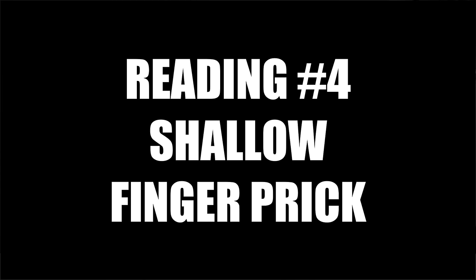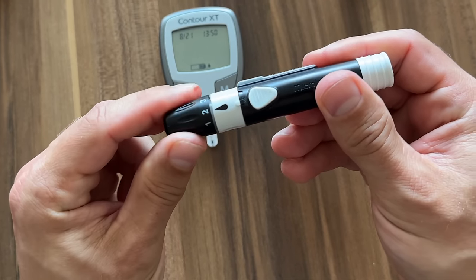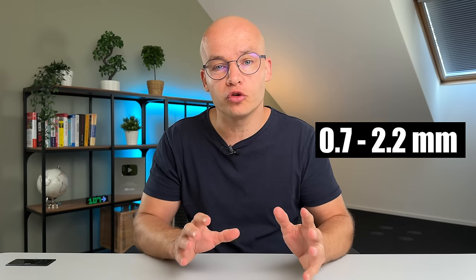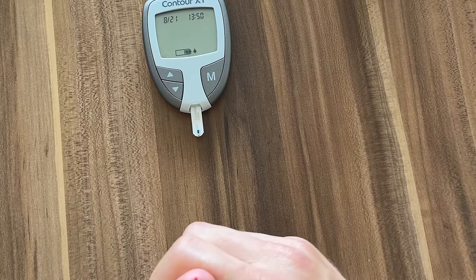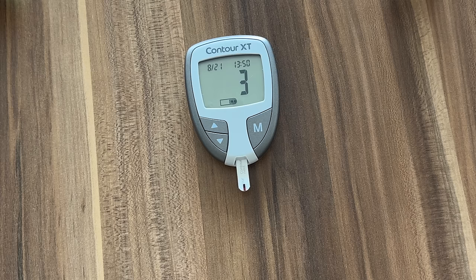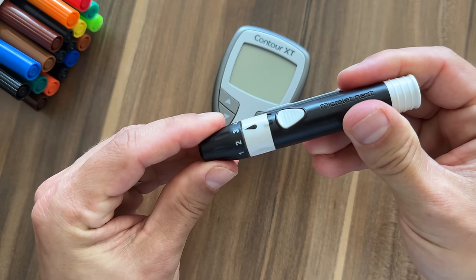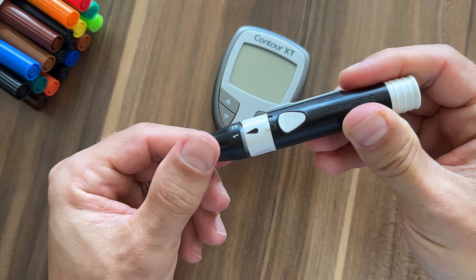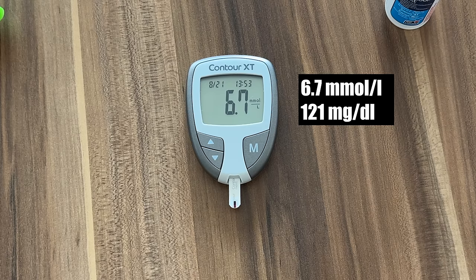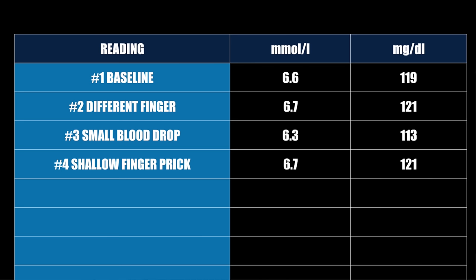For reading number four I'm reducing the depth of the finger prick on my lancing device — normally at position two, now moving to position one. The required depth is anywhere between 0.7 to 2.2 millimeters, and I'd heard that a more shallow prick might give a slightly lower blood sugar number. The finger prick definitely hurts less at this shallower setting, but I had to push much more to squeeze enough blood out. Most lancing device makers recommend starting with a more shallow setting and increasing depth only if you have really thick skin. The reading with the shallower setting is 6.7 or 121 — almost identical to our baseline.